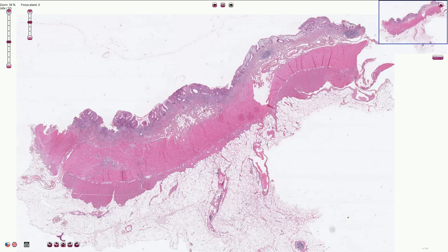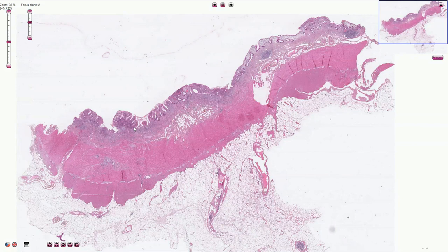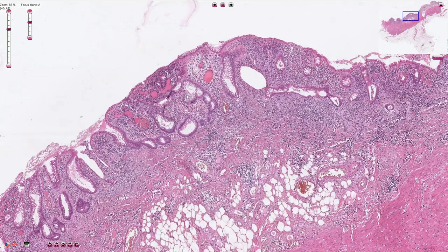Here we have the ulcerations and the partially affected mucosa in between the ulcerations. Ulcerations create inflammatory pseudopolyps. On higher magnification we can see the typical distortion of the architecture of the crypts, which is a sign of chronicity of the inflammation.